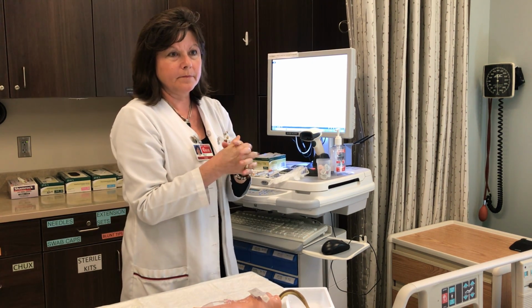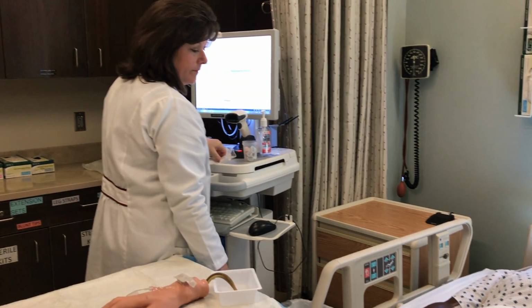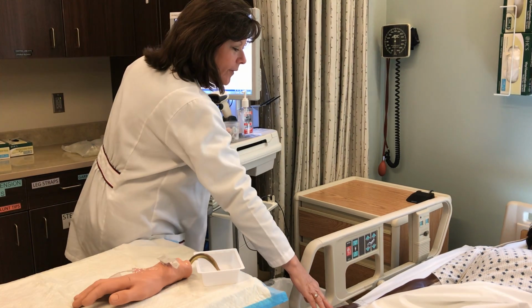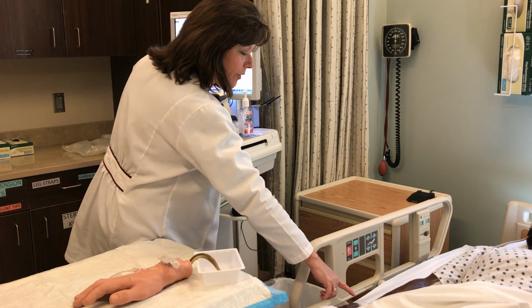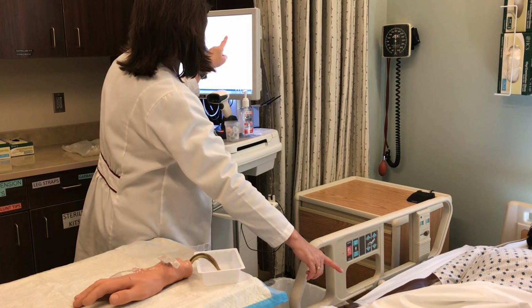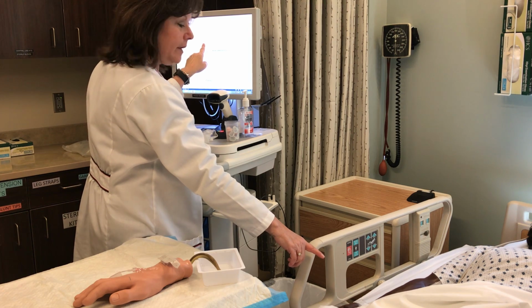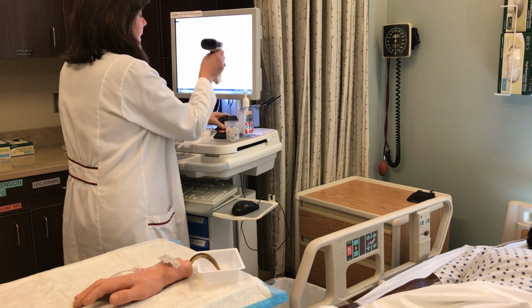Identify client using 2 identifiers and compare to MAR. Scan patient armband and verify allergies with patient. Can you state your name for me? Diane Curtin. Okay. And what is your birthday? June 14th, 1941. And do you have any allergies? No, I do not. All the information matches, and then I will scan her ID badge.